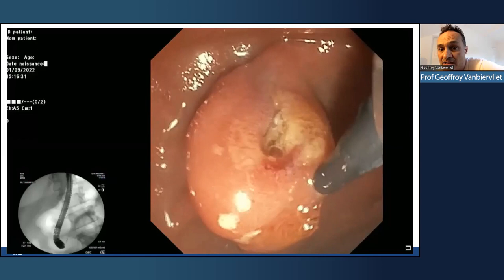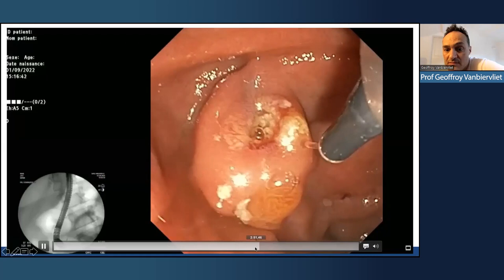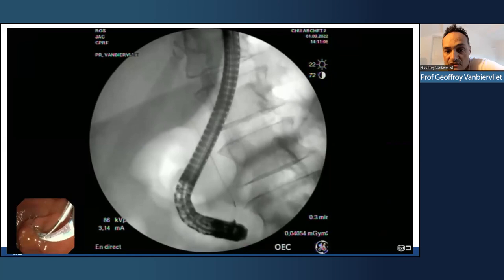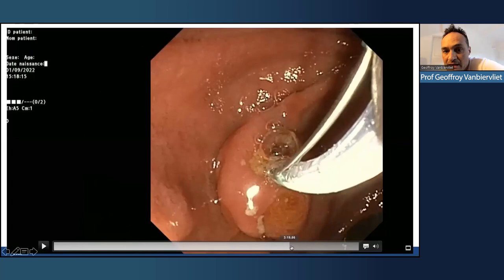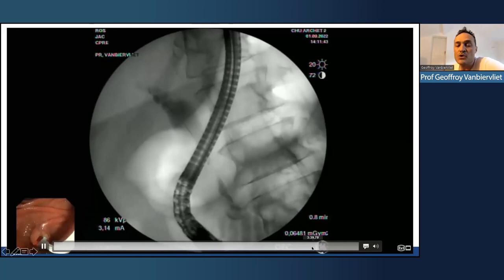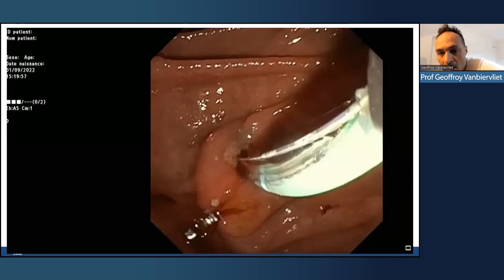And here you can see that we have a good access to the common bile duct with some bile, which is now visible, and we just have to introduce the tip of the guide wire and finish the procedure, as you can see with the fluoroscopy. So it is finally easy if you manage this procedure very step by step, and if you always respect the different steps like this. But always avoid the bleeding, which could be very difficult for the rest of your endoscopy if it occurs.